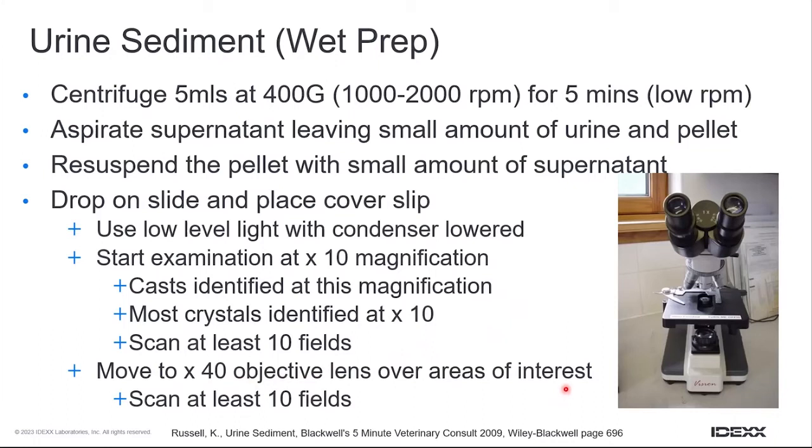So very simple to do, but a bit time consuming. And I think that's why it's often overlooked. I tend to find nurses are much better at this process than vets are, probably because they're infinitely more patient than we are. And as I say, if you have a SediVue, it does the same process for you. But either way, the sediment examination is a vital part of the full urine examination.